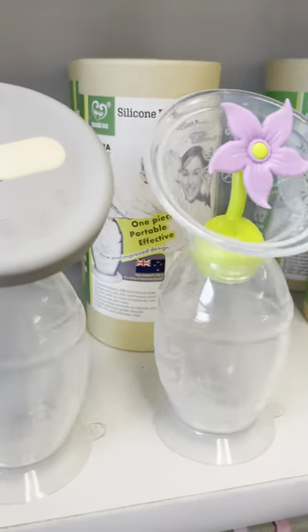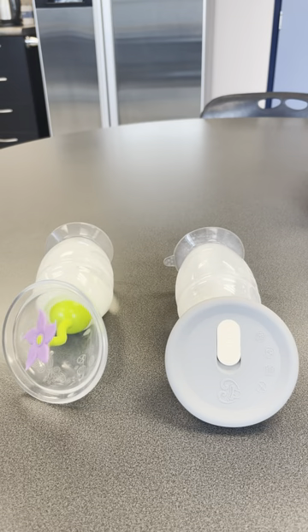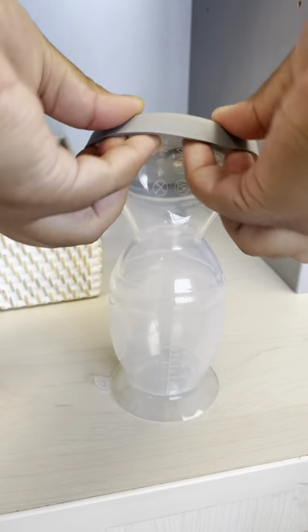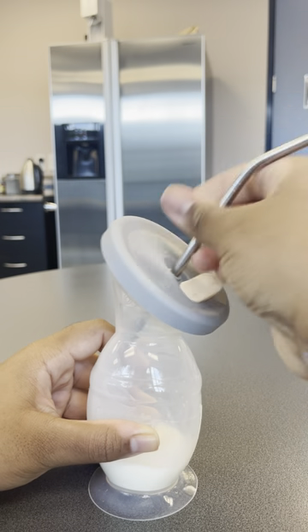What's the difference between the pump cap and the flower stopper? They both have the same function: to keep your precious breast milk from spilling. The pump cap covers the full flange, which keeps the inside of the pump free from germs and lint. There's a valve at the top to release any pressure, or you can even put a straw through it.